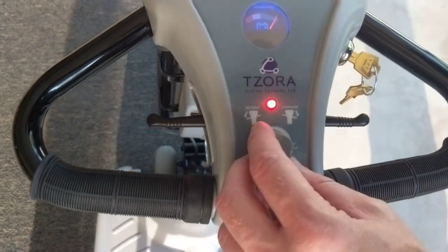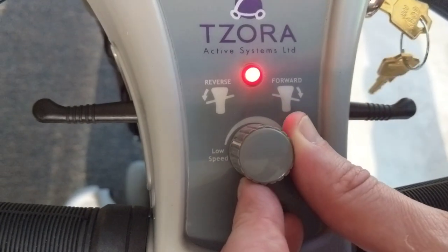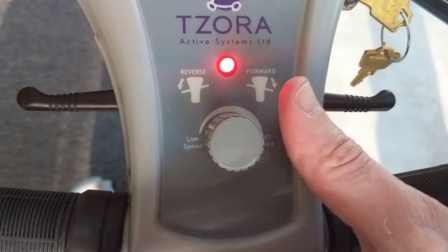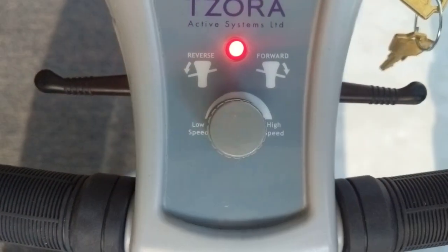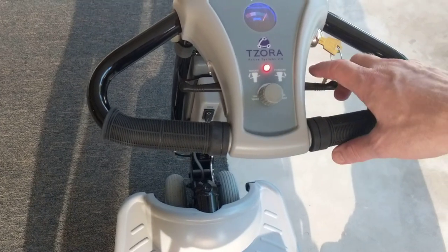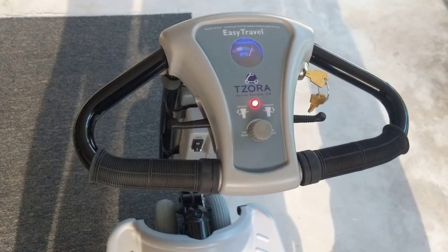Taking a look at the tiller again — it's very easy. There's a little knob on the front to turn the speed up to whatever speed would be best for you. There is a single lever that allows you to press one way to go forward and press the other way to go back.